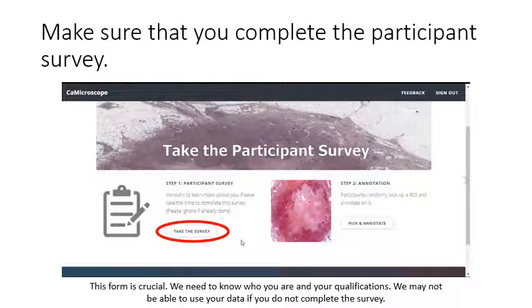You will then come to this screen. If you have not already, please make sure that you complete the participant survey. This form is crucial. We need to know who you are and your qualifications. We may not be able to use your data if you do not complete the survey.